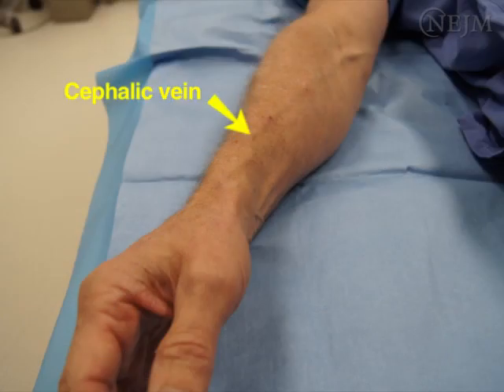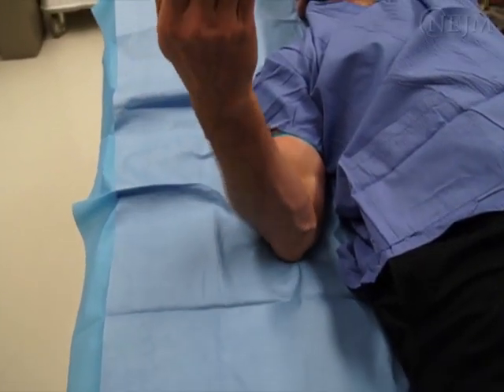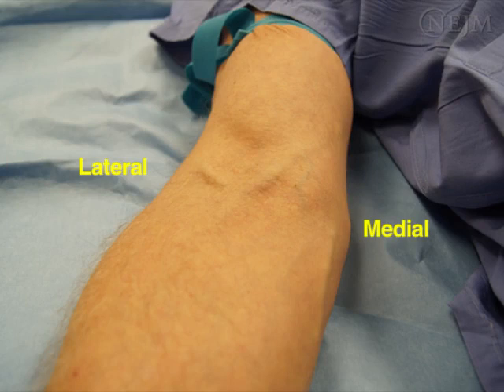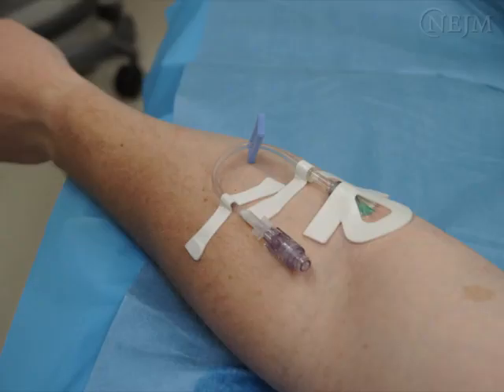The cephalic vein is usually prominent on the anterior radial aspect of the forearm. The basilic vein on the ulnar side of the forearm is often neglected because of its posterior position, but is usually prominent and often larger than the cephalic vein. In the medial antecubital region, the basilic vein is medial and the cephalic vein is lateral. The median cubital vein runs diagonally through the antecubital fossa, connecting the cephalic and basilic veins. Antecubital vein cannulation is common in emergency situations, but not ideal for long-term IV therapy.